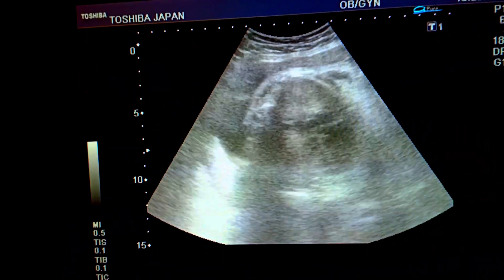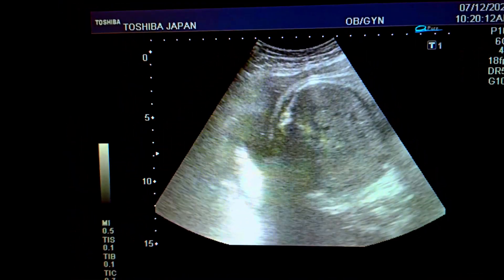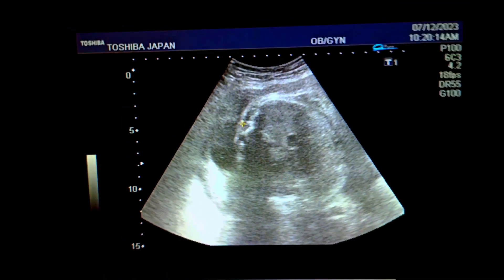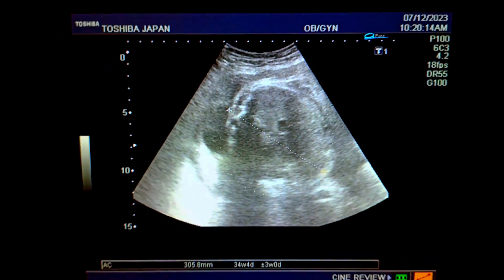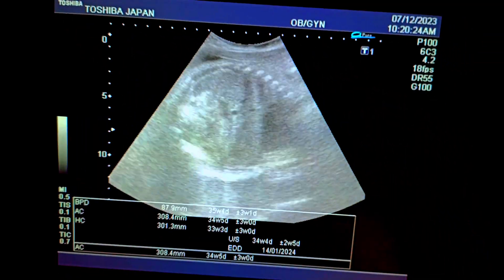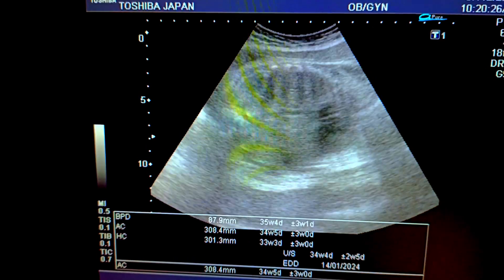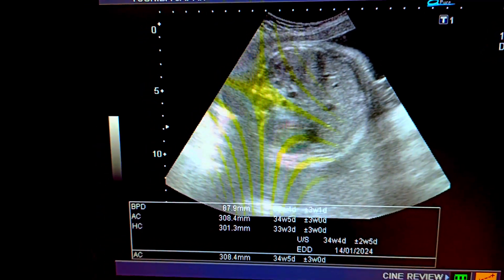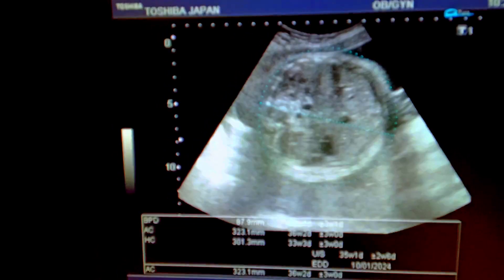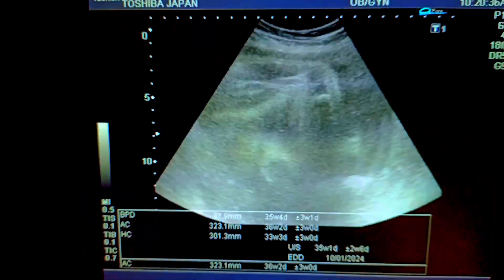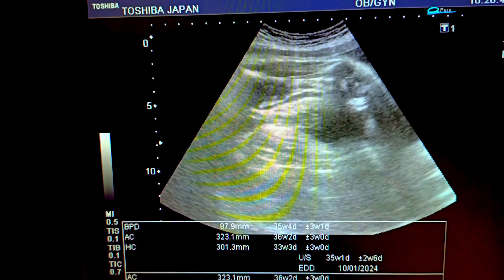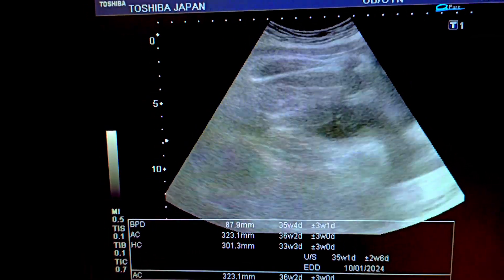We would like to find out the abdominal circumference at the level of the gastric bubble. This measurement also corresponds to 35 to 36 weeks of pregnancy. See the abdominal circumference. Now I would like to measure the femur length to find out the body weight and date of delivery.